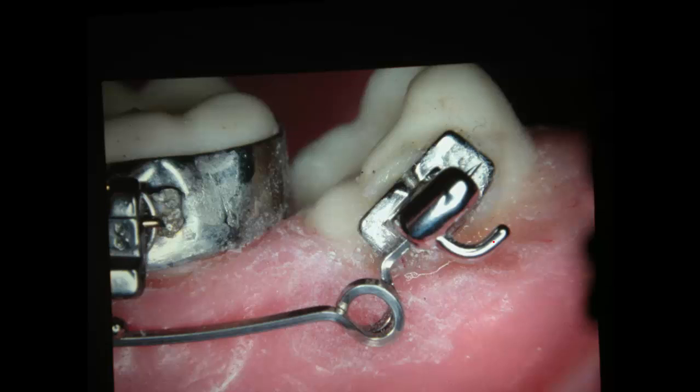Now, here we put the loop down. In some cases you might want to put the loop down, but most of them, nearly all of them, you're going to just turn it up like this. It's much more simple to do this. Now, if you're bending this particular little loop, it's a little different.